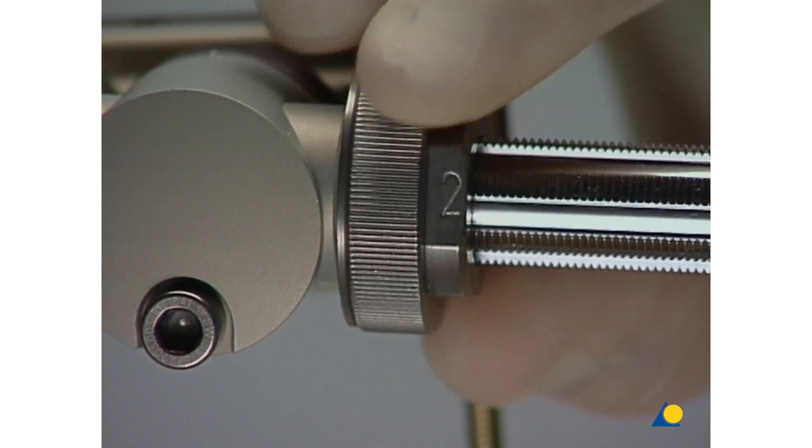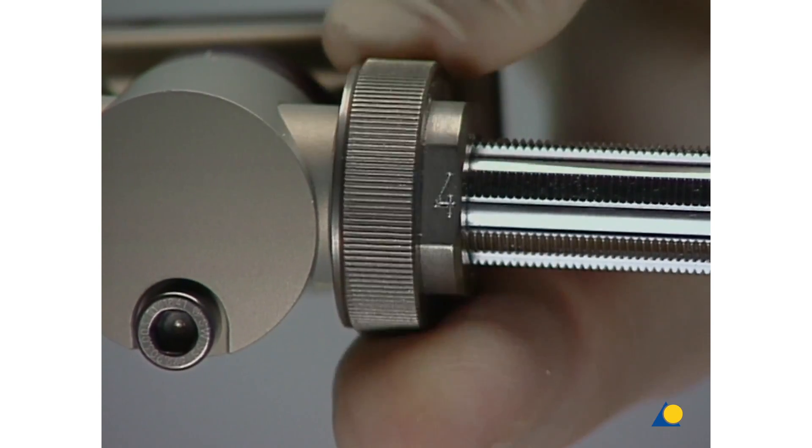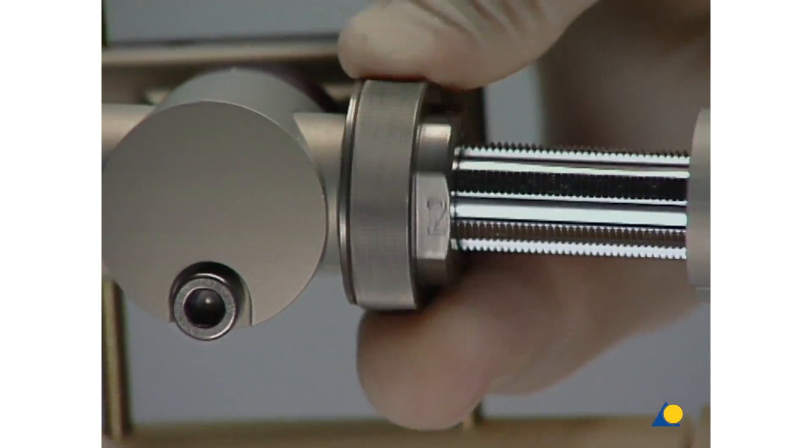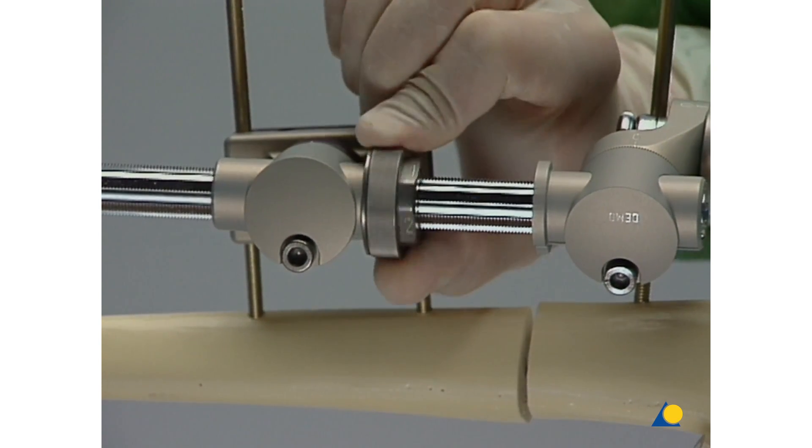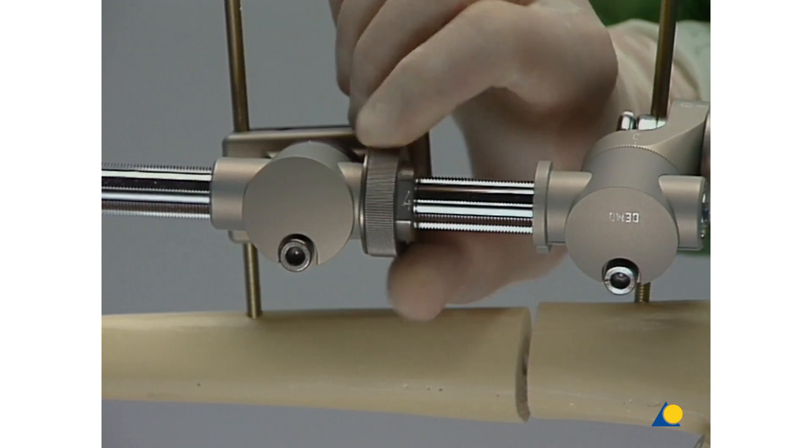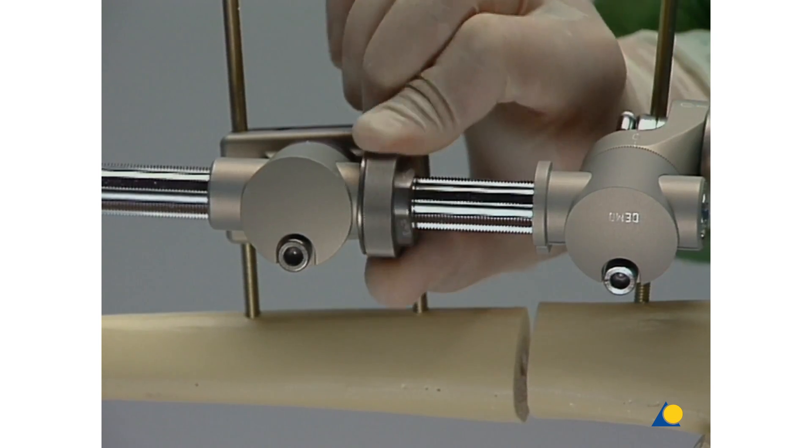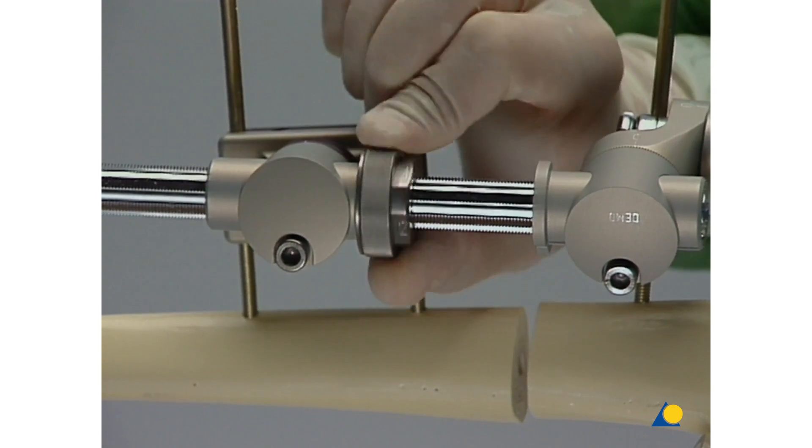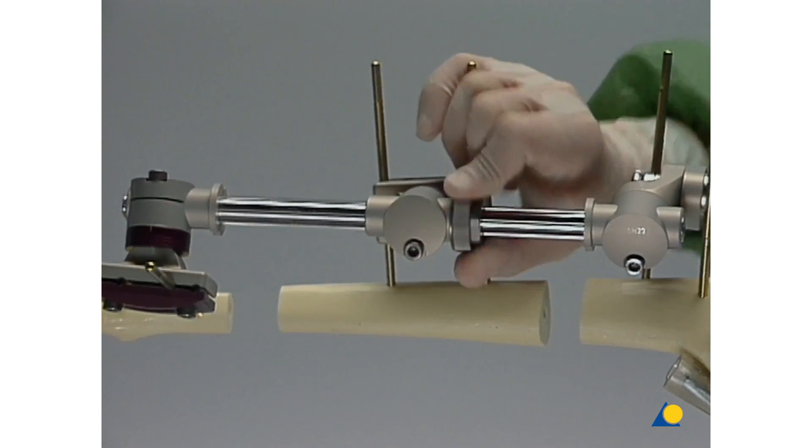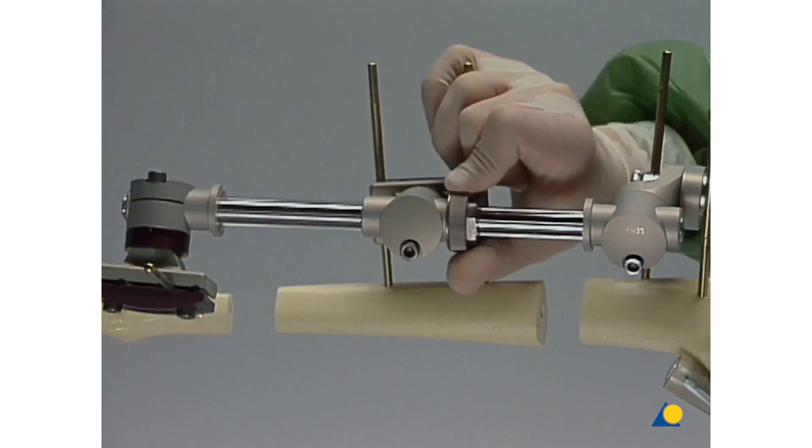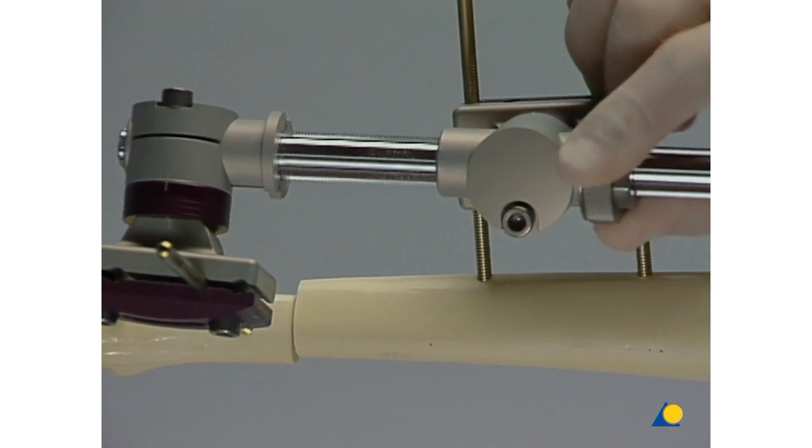The segment transport can now be simulated by turning the large nut on the segment transport sleeve. Each full rotation of the nut corresponds to one millimeter of transport. Every full rotation, and thus each millimeter, is divided into four portions, which can be felt as the nut engages. This division is marked one to four on the nut. The segment is transported into the defect.